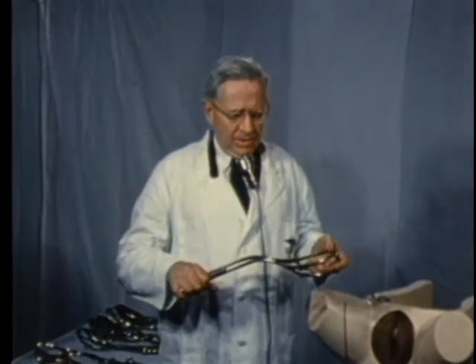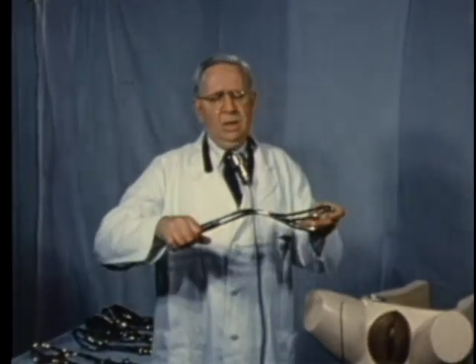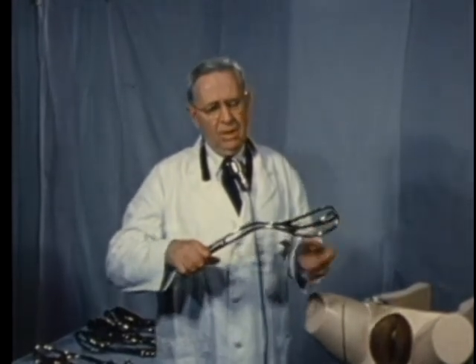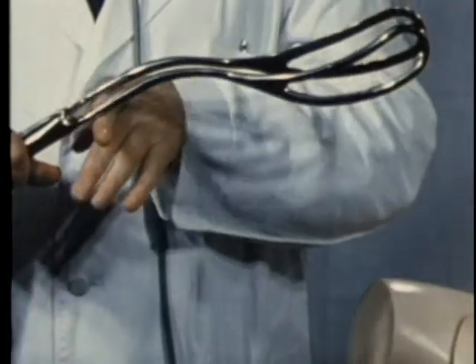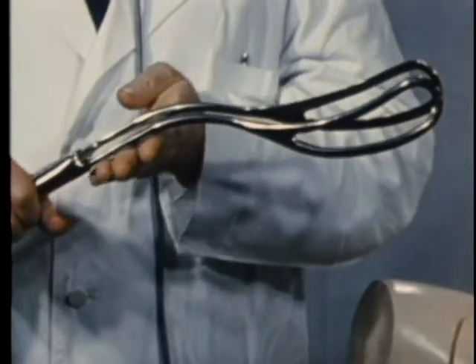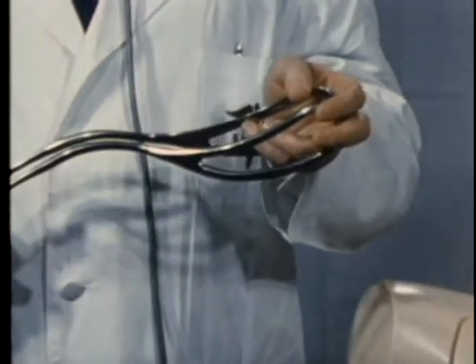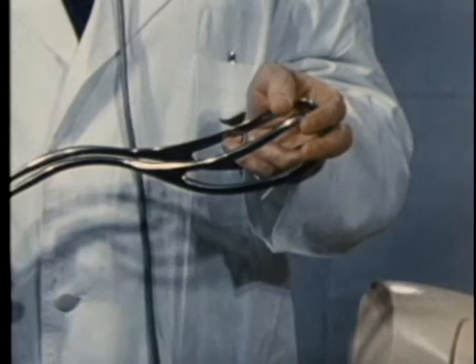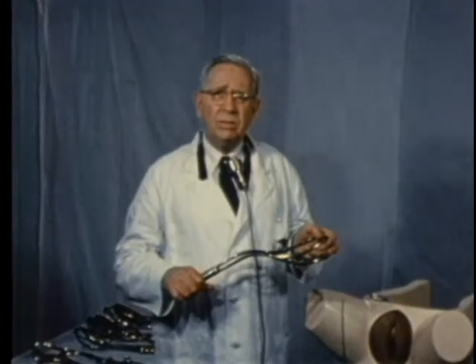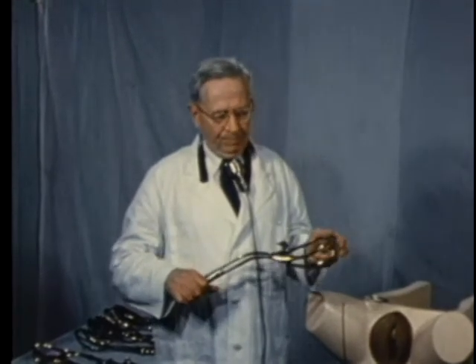The advantages of this instrument lie in these points of construction. The extra long shanks with the backward bend to the handles and the adjacent portion of the shanks permit an easy, accurate application directly to the sides of the head without the necessity of elevating the body much above the horizontal.